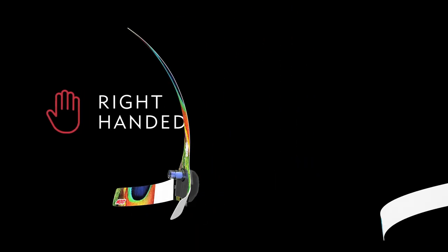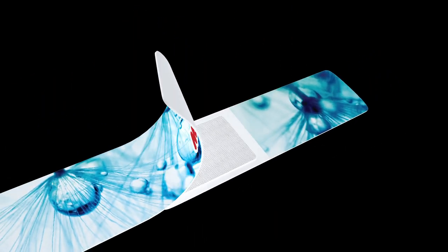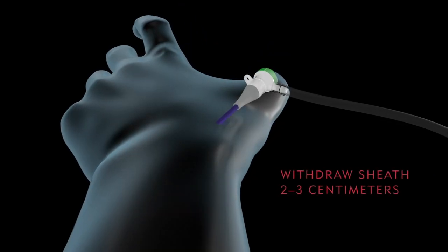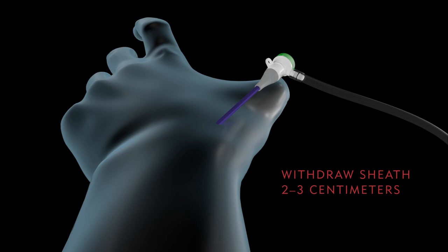The band comes in both right and left-handed configurations and includes an optional extension band. Before you place the device, make sure the site is clean and dry. It is recommended that you aspirate the sheath, then withdraw it approximately 2 to 3 centimeters.